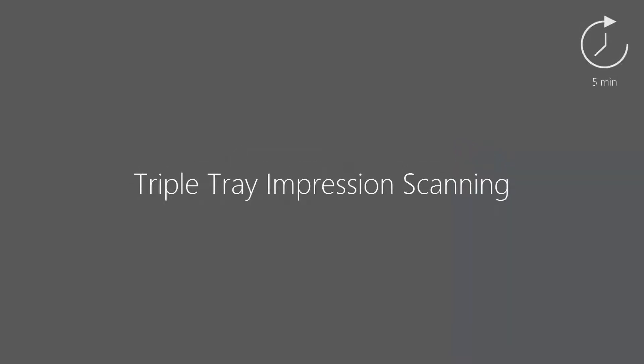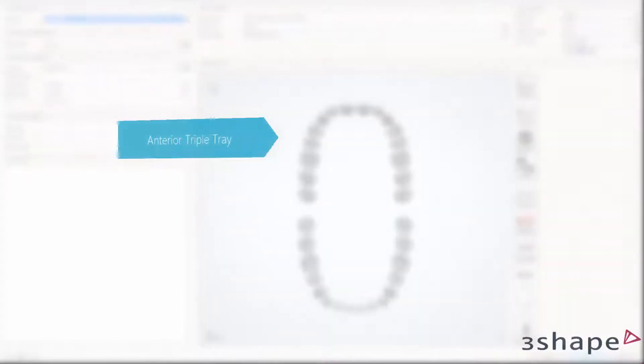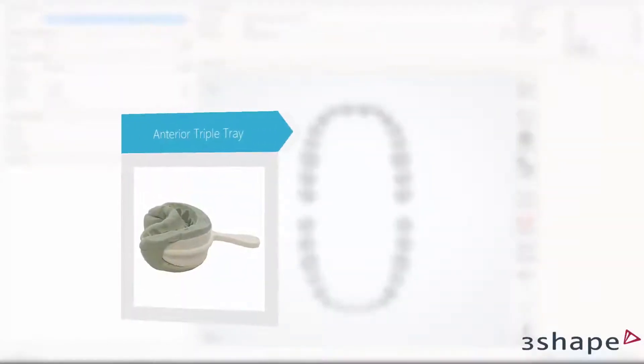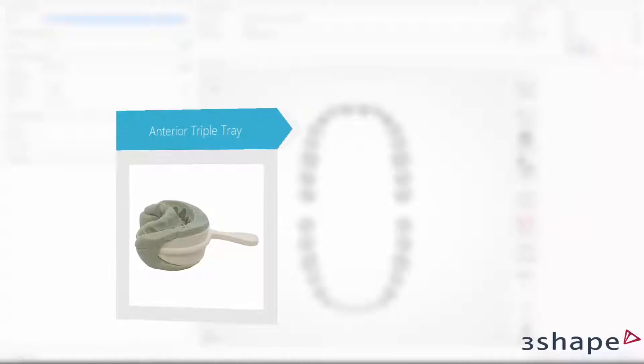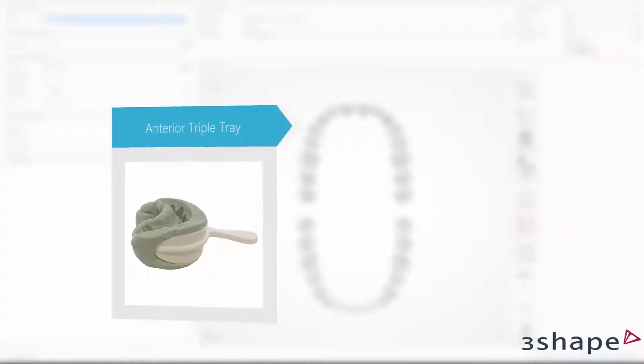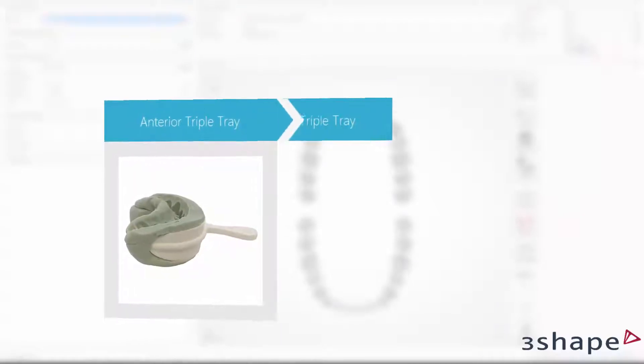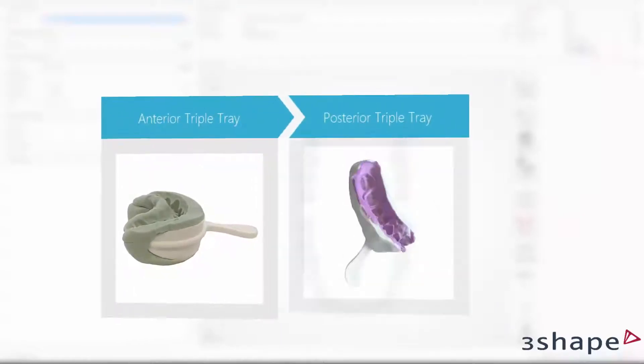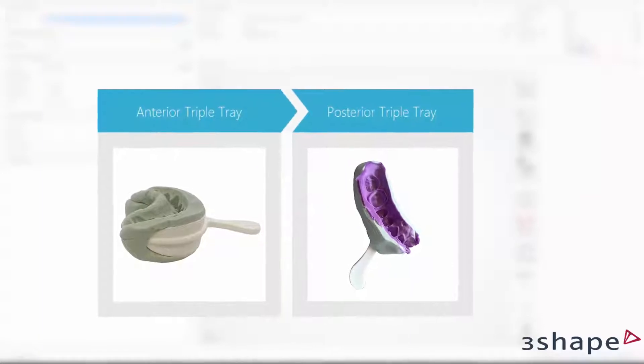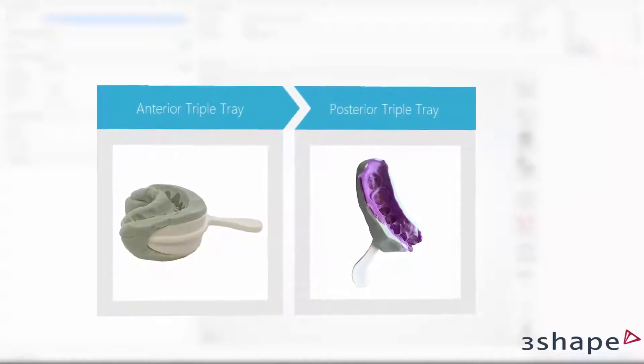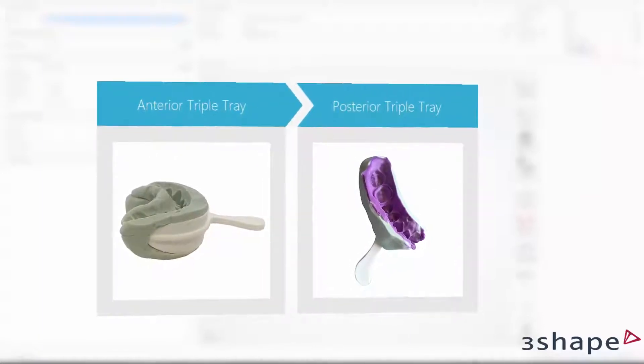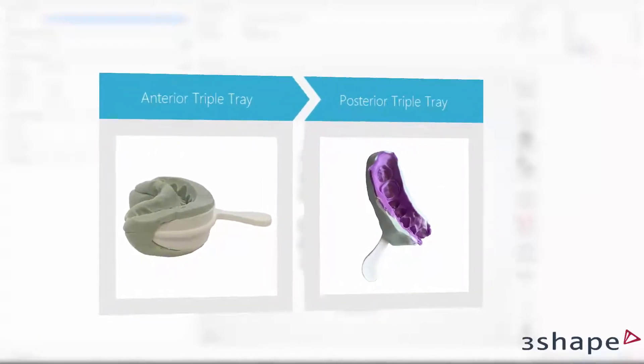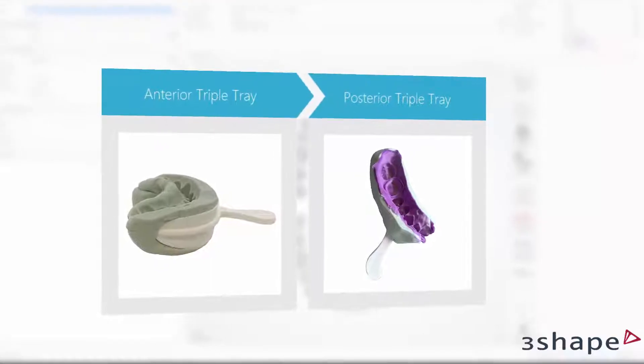Watching this video will help you learn how to scan triple tray impressions. This type of workflow may be useful for model-less full anatomy crown production. It will save your time and resources on model production. At the same time, it allows dentists who are not yet TRIOS users to join model-less digital production.